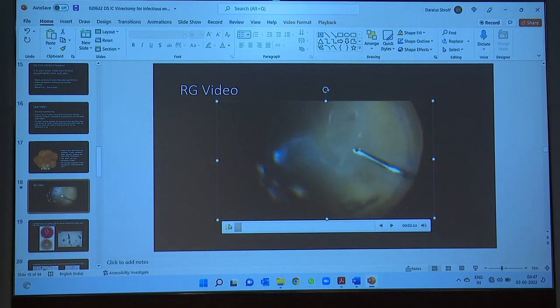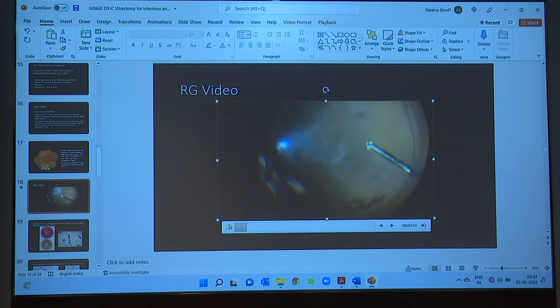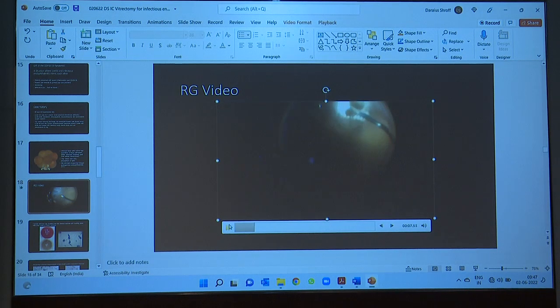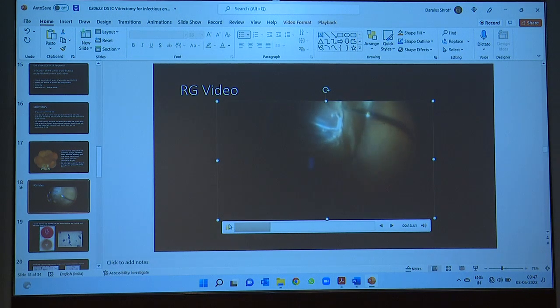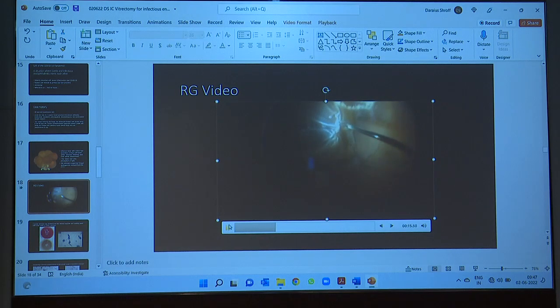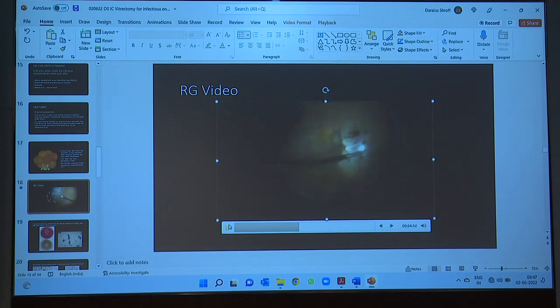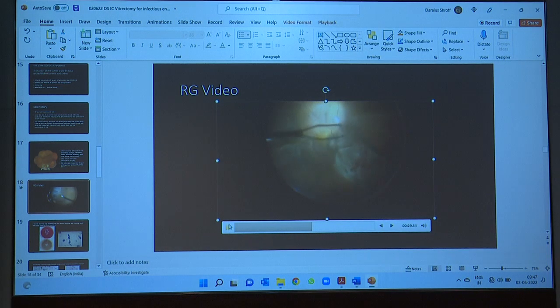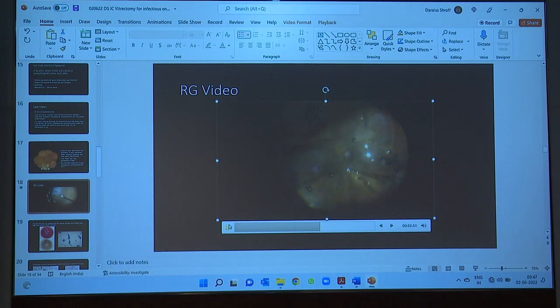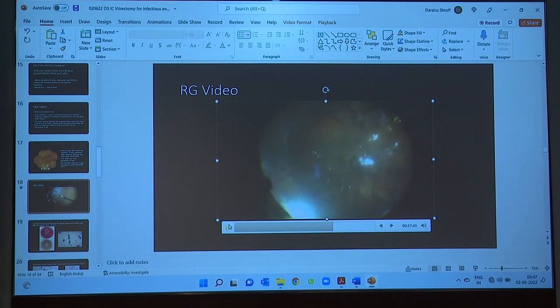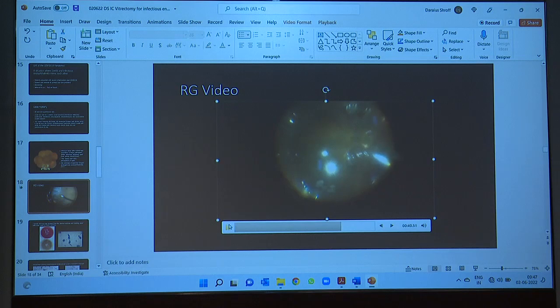Here you can see we are removing fluffy white exudates from the vitreous cavity. We went into the abscess and, using a technique shown by Dr. Sangeet, we connected a syringe to the port and obtained a sample for the laboratory. There were also lots of membranes, so we performed some bimanual work with the light pipe and forceps to remove the membrane tissue, which was maximal in the superior nasal area. Because of the RD and fulminant infection, this patient needed silicone oil tamponade, and we also performed 360-degree laser.